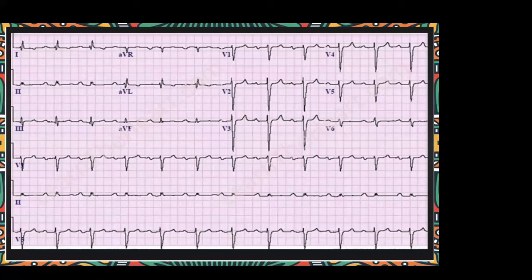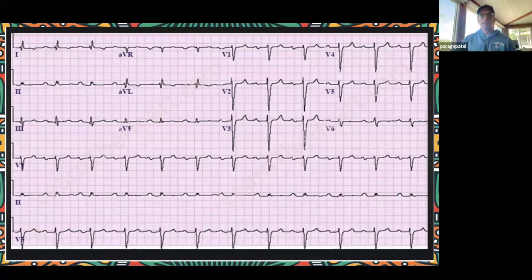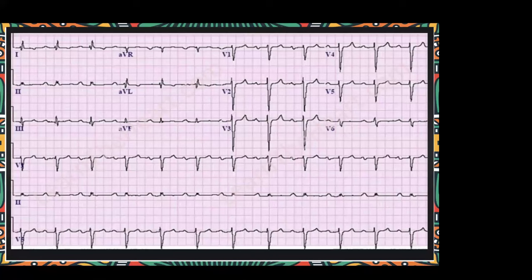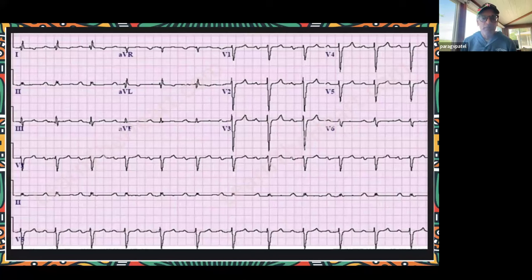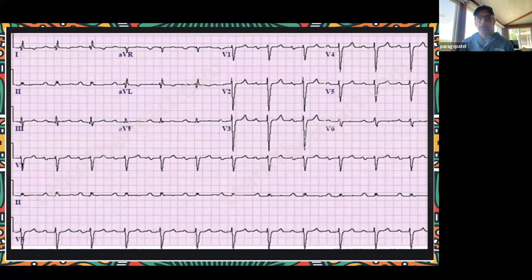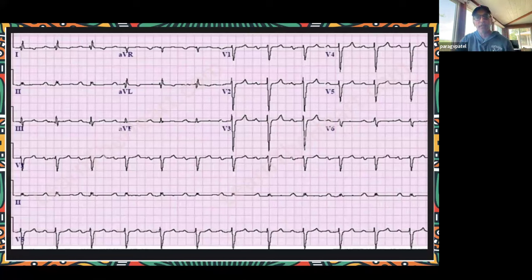First degree AV block coming in. There's one P wave for each QRS, the PR interval is prolonged, but this rate is sustained. It would be a rare individual who is terribly symptomatic unless they had chronotropic incompetence where the heart rate doesn't go up with physical activities. That would be a rare instance where a pacemaker is required.